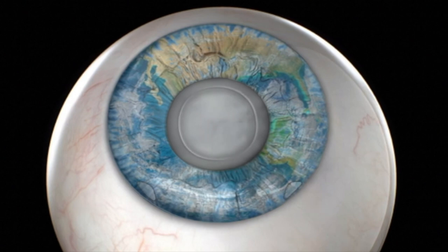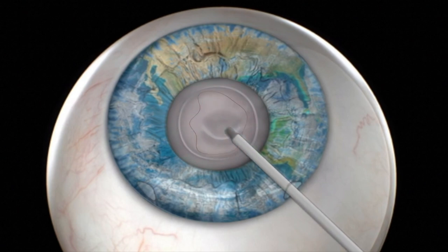A circular incision is made to the lining or capsular bag enclosing the lens and removed. This opening allows the lens to be extracted without removing the capsular bag. An ultrasound probe is then used to break down and gently remove the lens with suction.